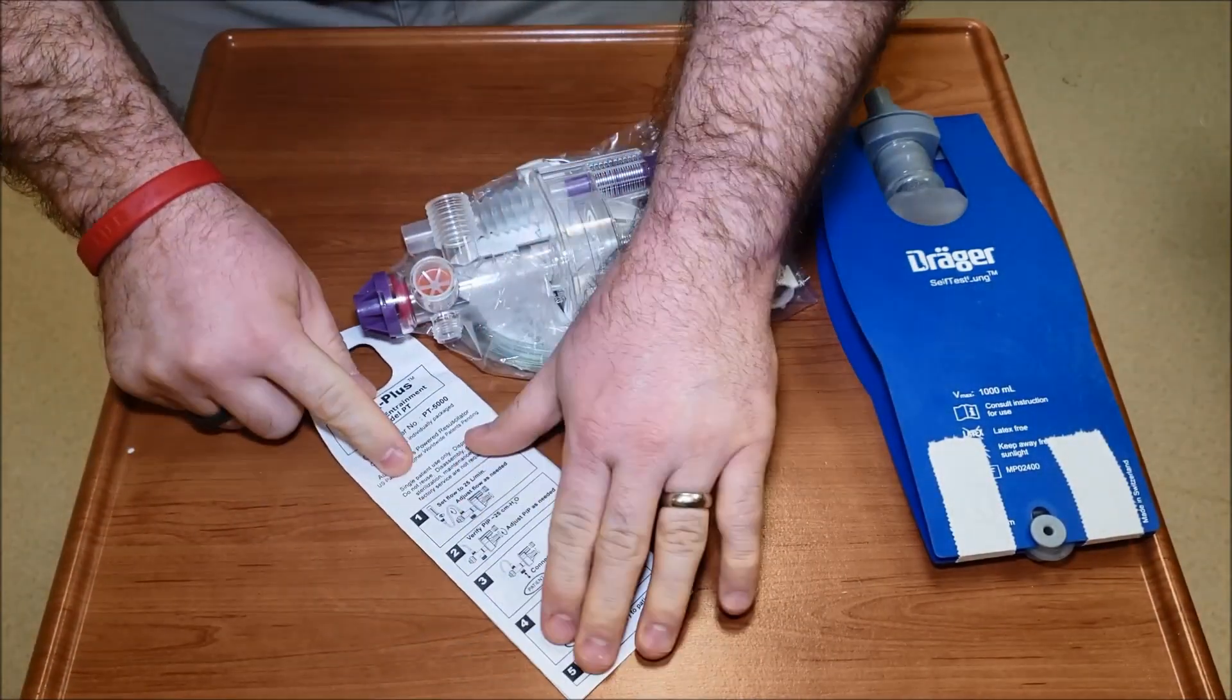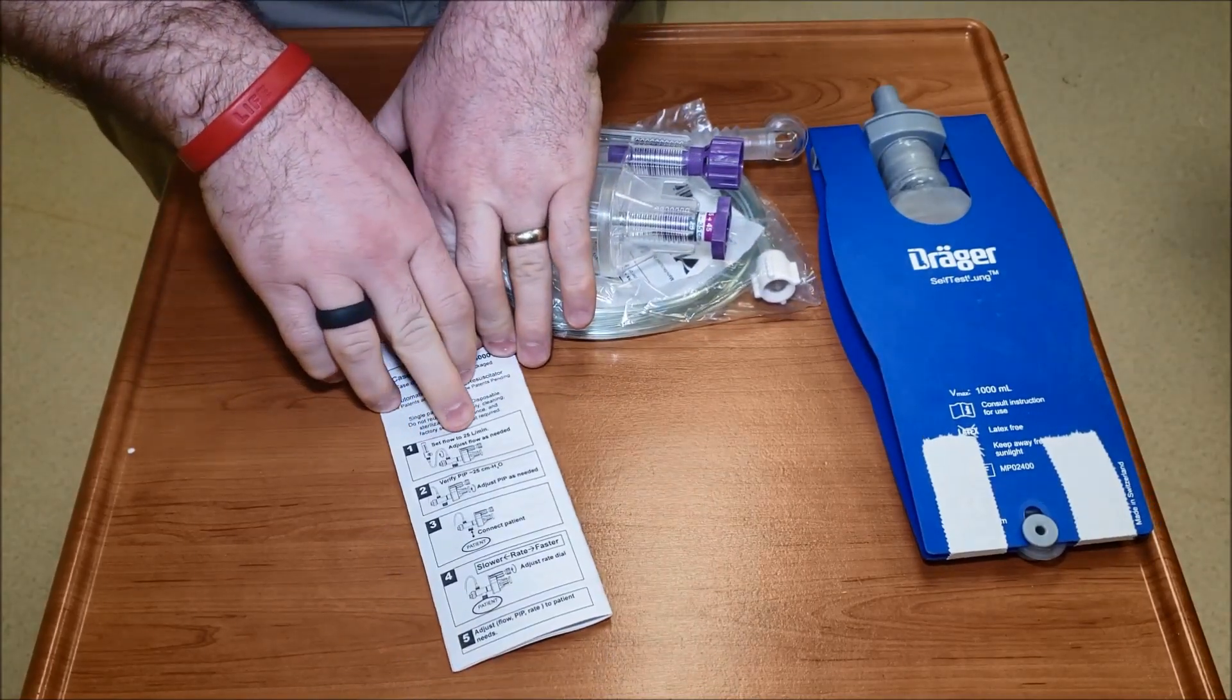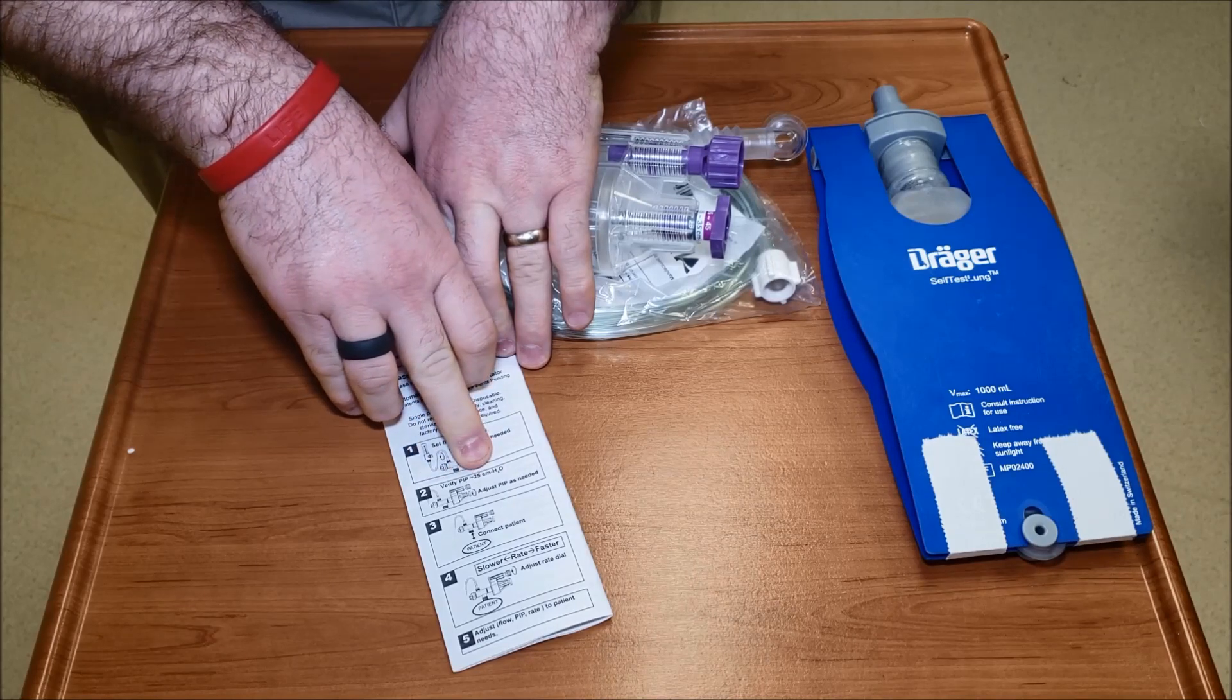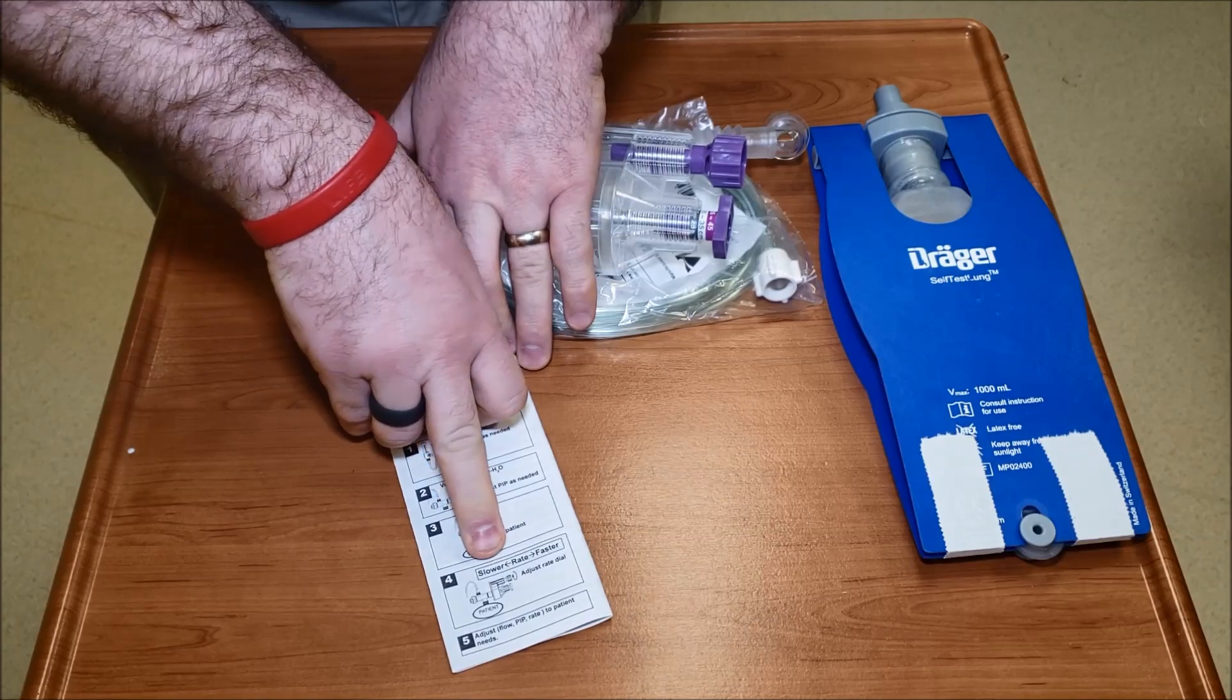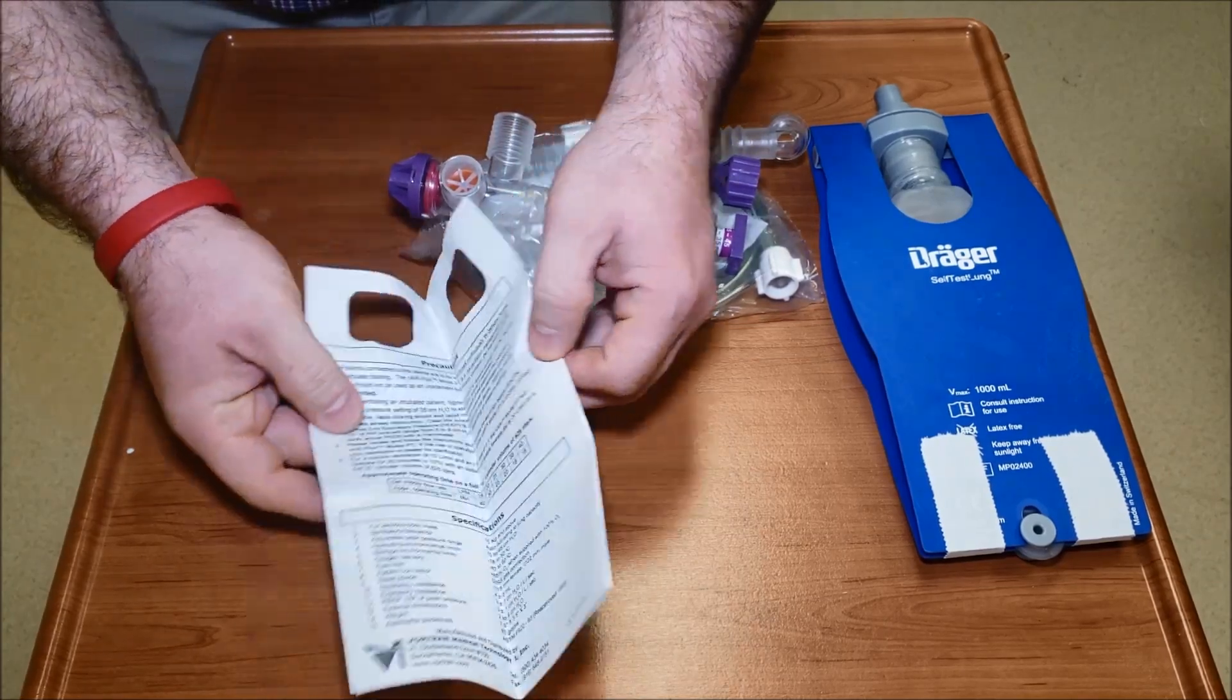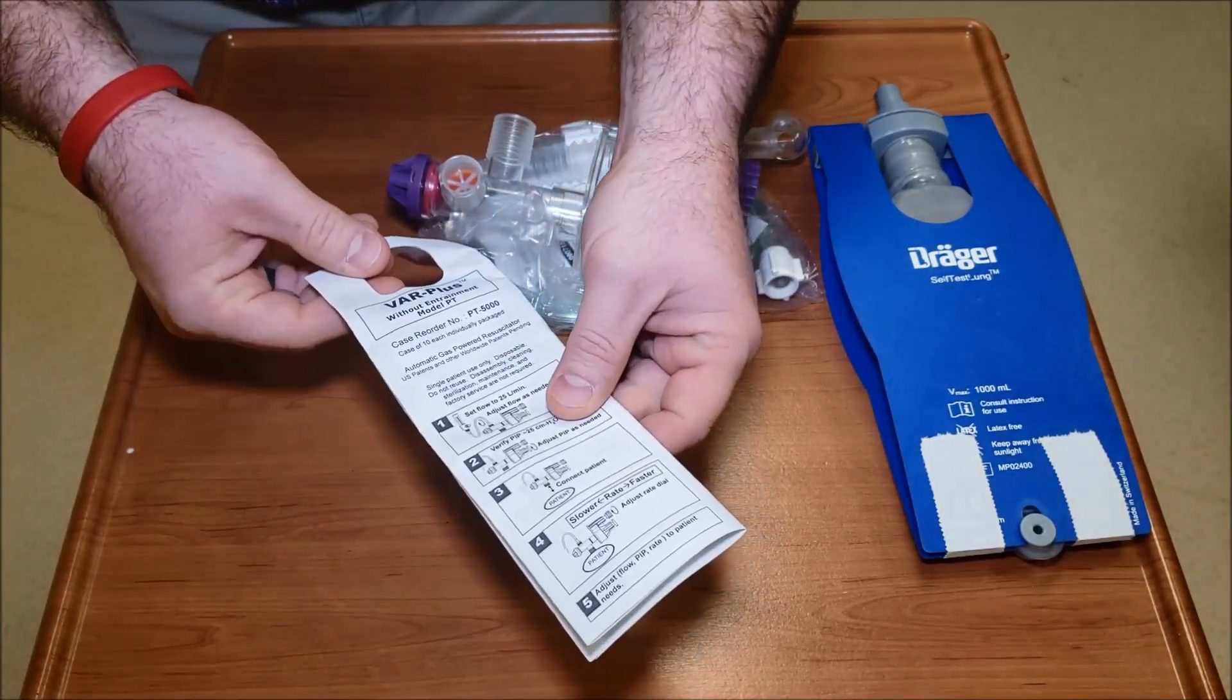This is just so that in a pinch anybody could set this thing up. You can see we have: one, set flow to 25 liters per minute; adjust the PIP to 25 approximately; connect the patient; and then you can change the rate. We'll go through all this stuff, but this is a little generic kind of instruction sheet for how to use it.